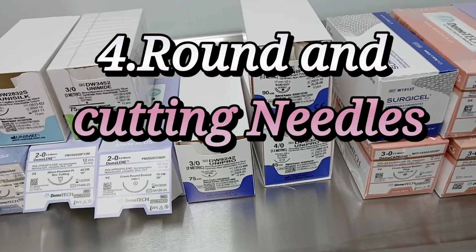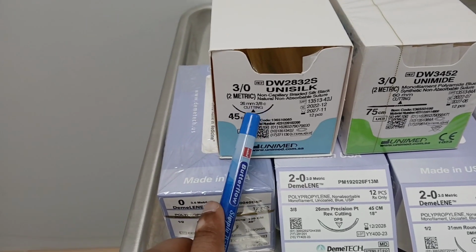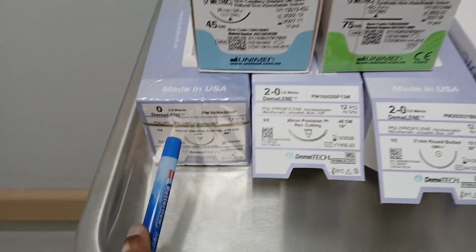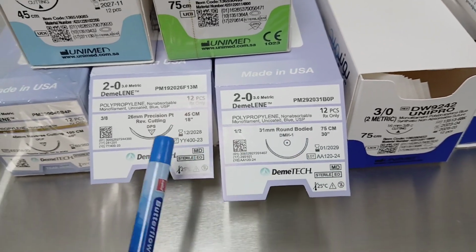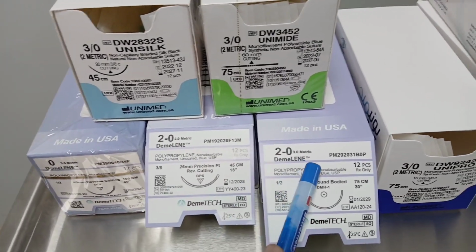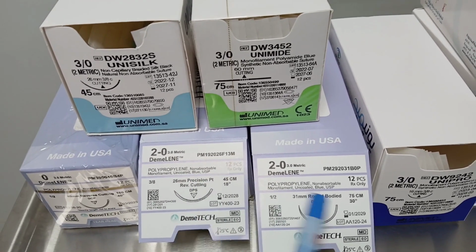Finally we are going to see how to differentiate a round needle and a cutting needle. Here you can see they have mentioned cutting needle. This is mentioned straight needle. This also is reverse cutting. This one is reverse cutting, round body. So like that we have to check the suture material. Sometimes we have the same number, for example 2020, then we get confused whether this is round or cutting. So immediately we have to check: cutting, round.